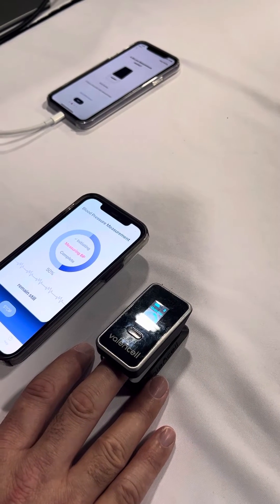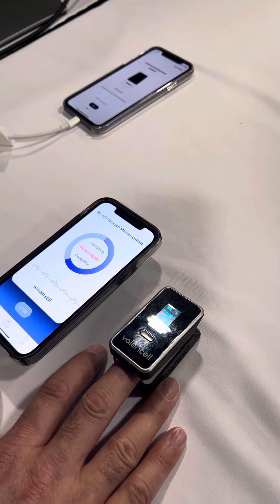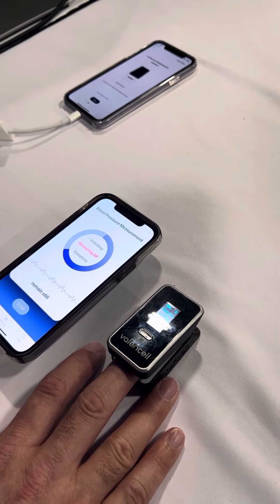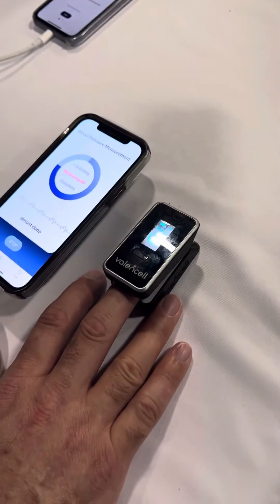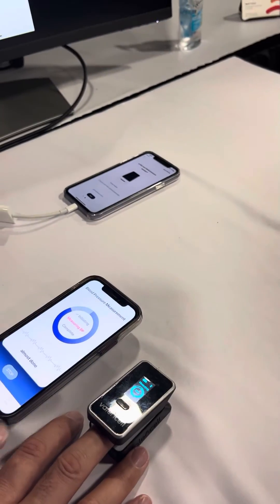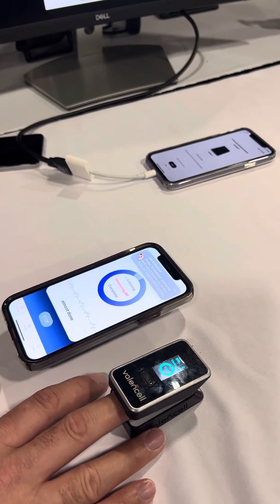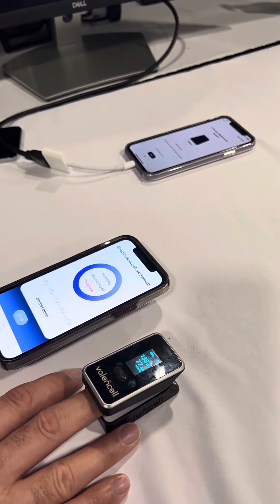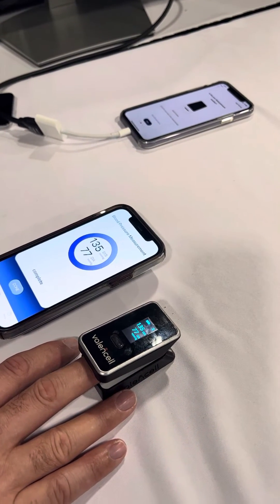Once we collect a suitable amount of data, we will provide an estimate of the blood pressure. It will report the blood pressure both on the clip as well as the app. The device can be used on a standalone basis or in conjunction with the app. You can see it's estimated to be about 135 over 77.